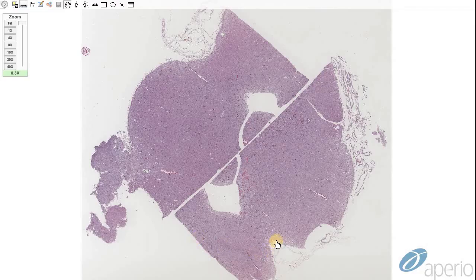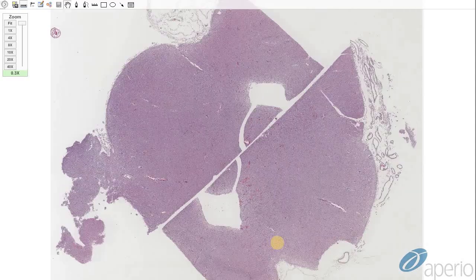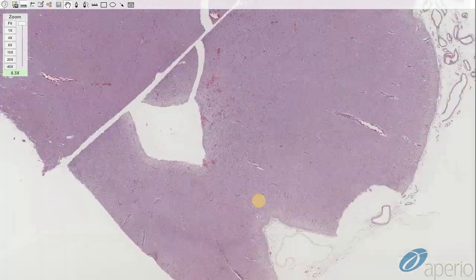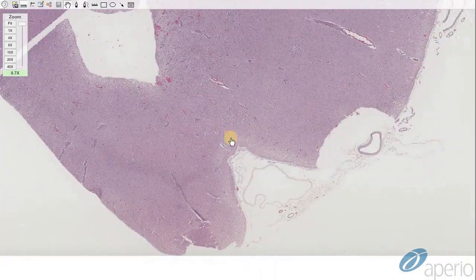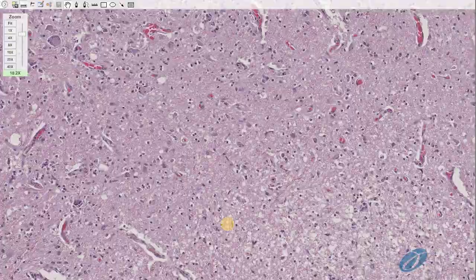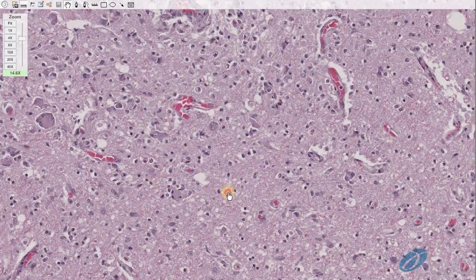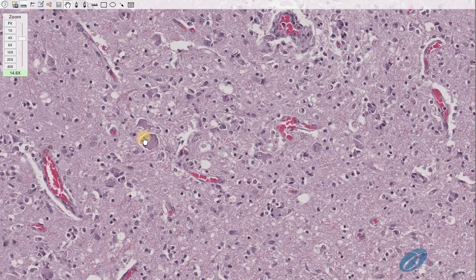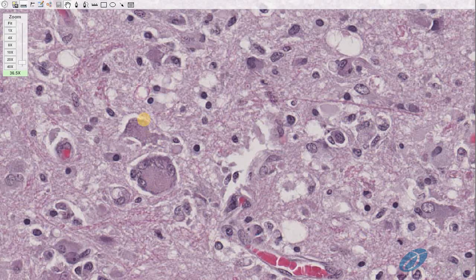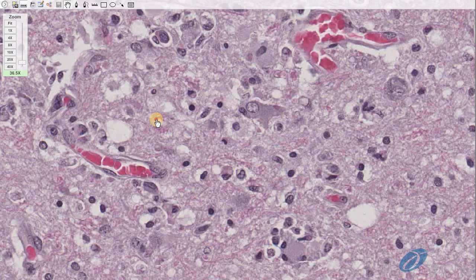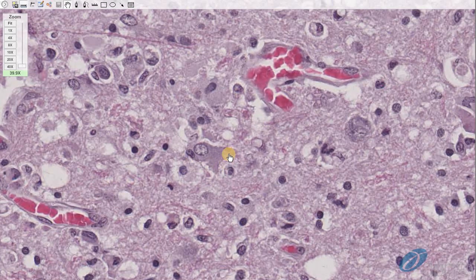This is a section from a seal brain infected with distemper virus. At higher magnification, we can see spongiosis and demyelination in addition to syncytial cell formation. Looking around, we can also find cells with intracytoplasmic and intranuclear inclusions, including this intracytoplasmic eosinophilic inclusion.